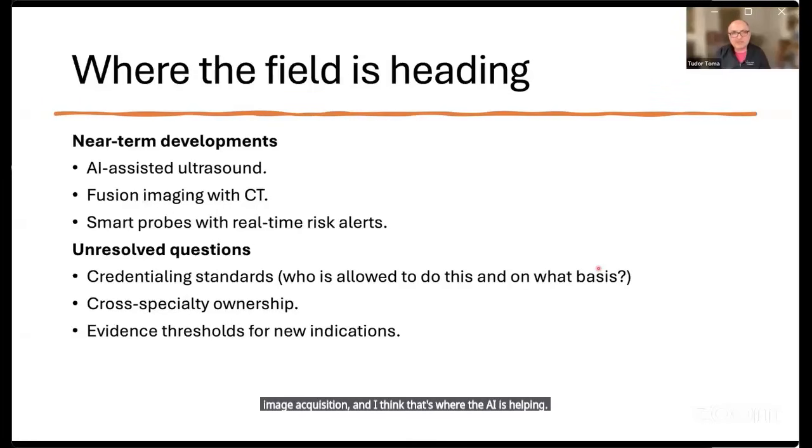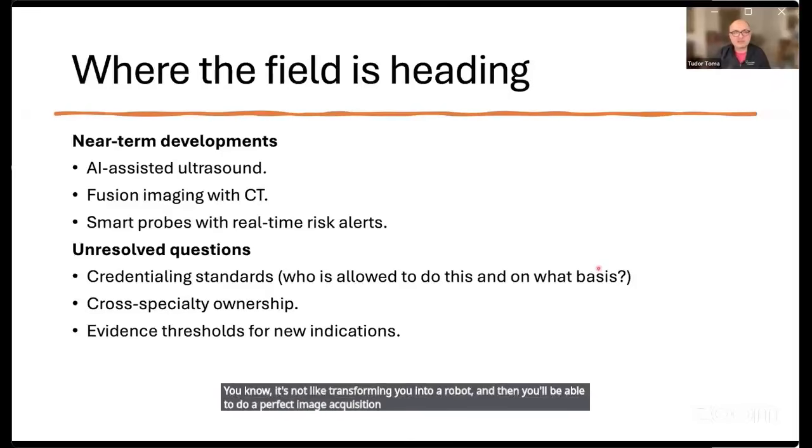My experience with AI-guided image acquisition is not that it will help you immediately, directly. It will tell you where you may improve, but then you still need to improve a little bit by yourself, if I may say so. So you need a bit of practice. It's not like transforming you into a robot and then you'll be able to do a perfect image acquisition because AI is telling you how to do it.